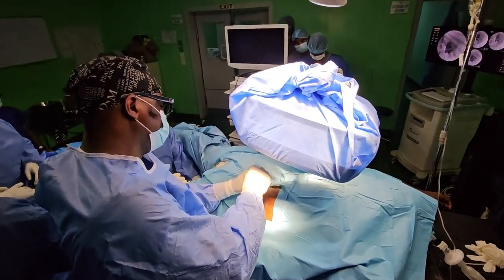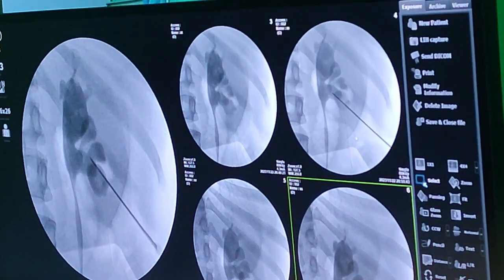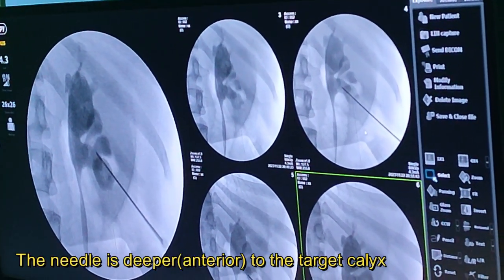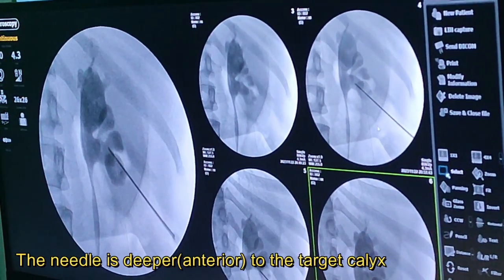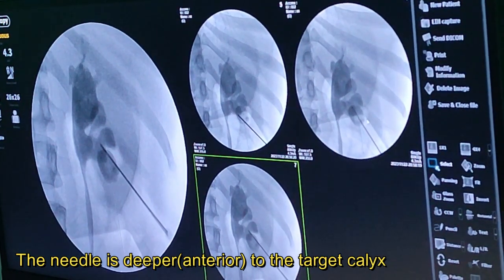That's the tricky thing. It's possible. So you see, what we do, I will reorient it in zero. It's always better to reorient in zero and check your depth in this thing.